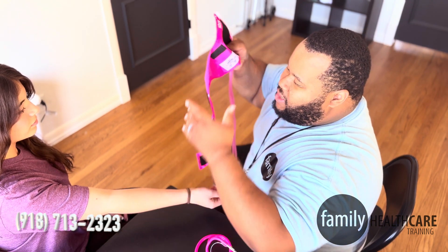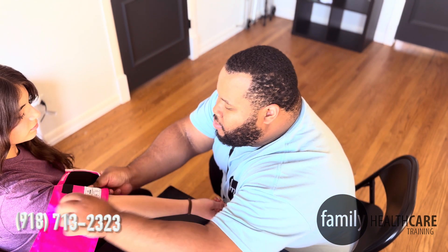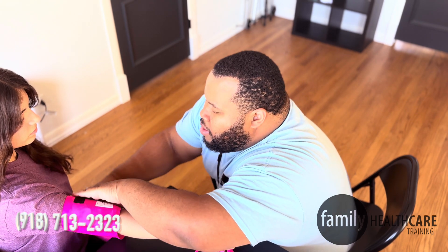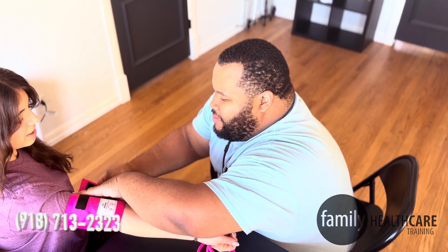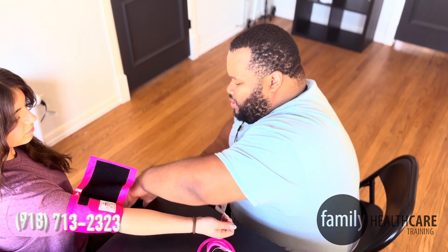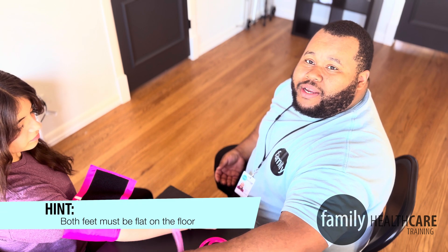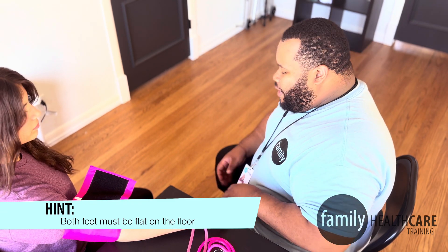I'm going to have you put your arm out — it's going to be a little snug. Just like that — you can relax that arm down. You want to make sure your patient's arm is relaxed and that they have both feet flat on the floor.